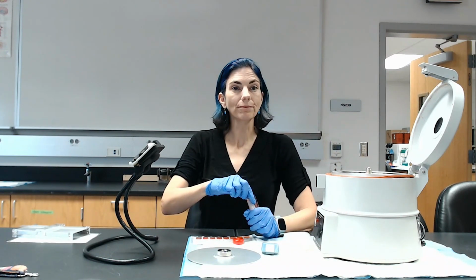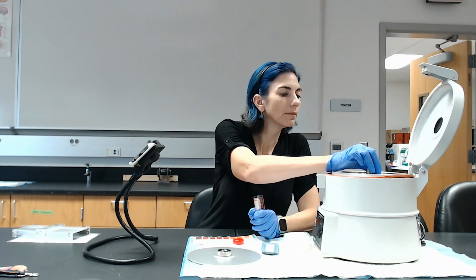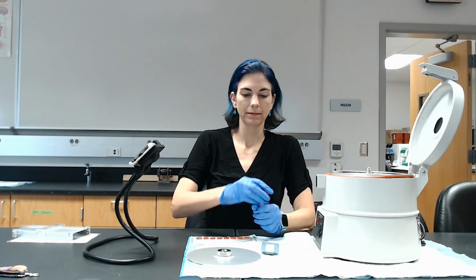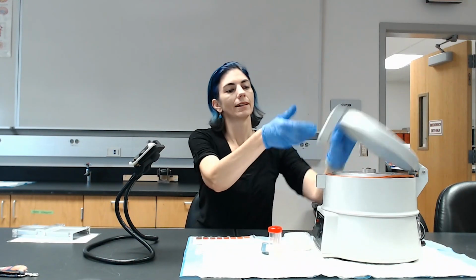And I'll spin it down, and then we'll take a look at the results. All right, it needs to spin for about 3 minutes.